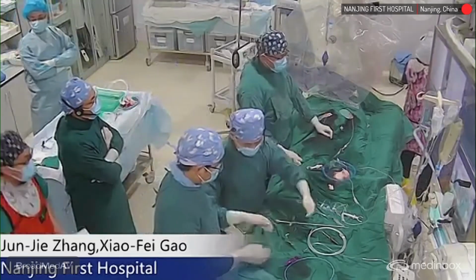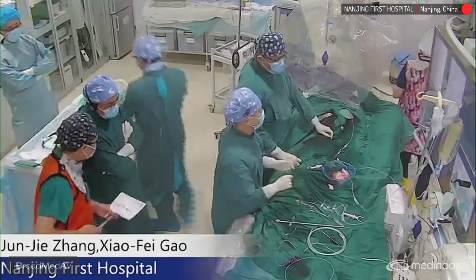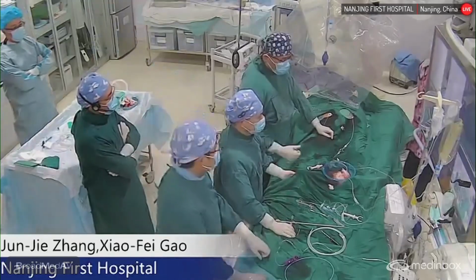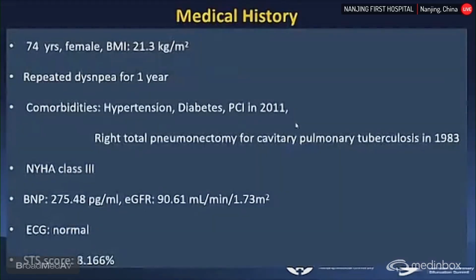This is Nanjing First Hospital, the second live case, a TAVI case. On behalf of Professor Xiaoliang Chen, I'm Dr. Junjie Zhang. On my right side, I introduce my team, Dr. Hongxiang Quan and Dr. Ye. Today's moderator is Dr. Gao Xiaofei. Today, our live case is a TAVI case for severe bicuspid aortic stenosis. Our echocardiographer image doctor is Dr. Zhang Quan. So first, let me introduce our case.